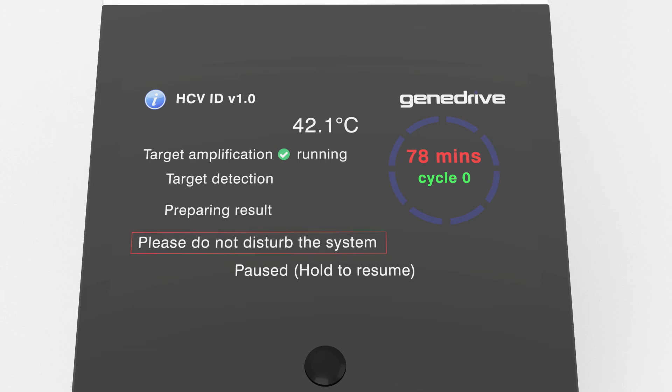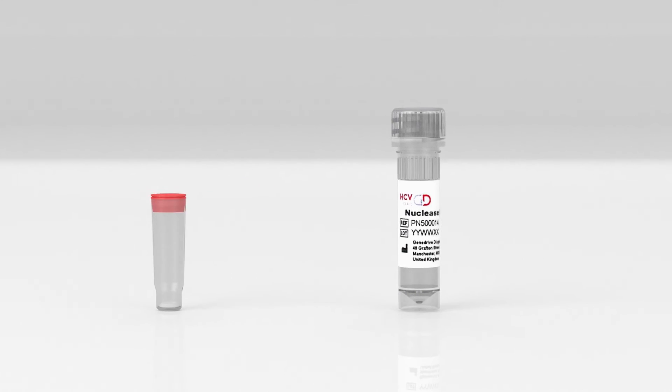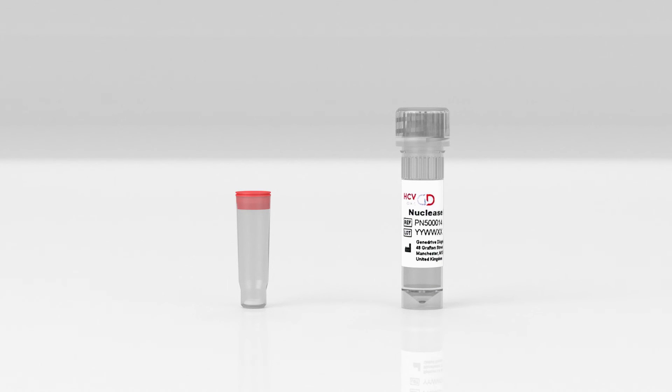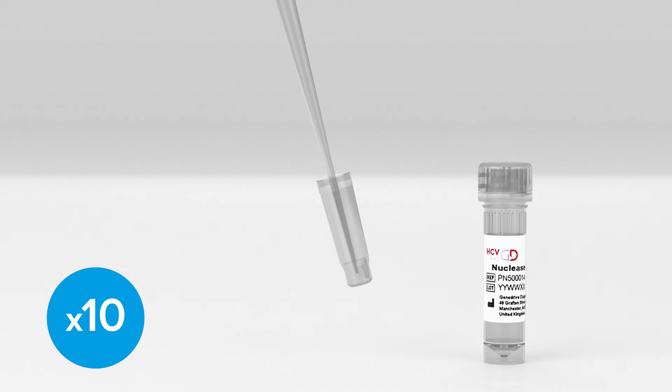Once the reaction is complete, the instrument will beep and display the message 'paused, hold to resume.' Next, remove the HCV ID assay tube from its foil pouch. Ensure that the white pellet is located at the base of the tube — this contains all the reagents needed to perform the RT-PCR. Discard the tube if the pellet isn't present. If the material is loose, tap the tube to settle it to the bottom. Next, take 100 microlitres of nuclease-free water and add to the centre of the HCV ID assay tube. Discard the red lid. Once the reagents have dissolved, gently pipette up and down at least 10 times, taking care to avoid frothing.